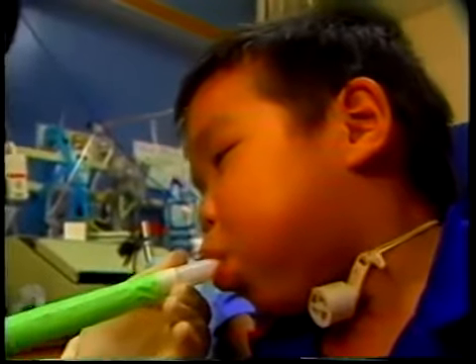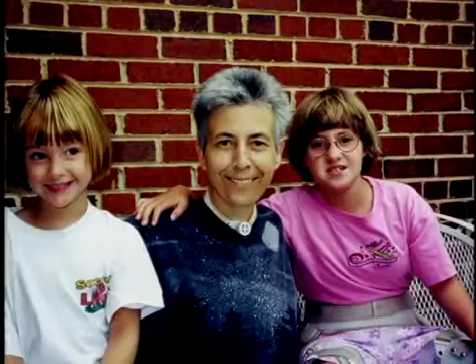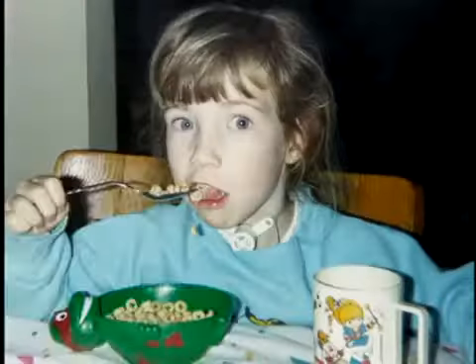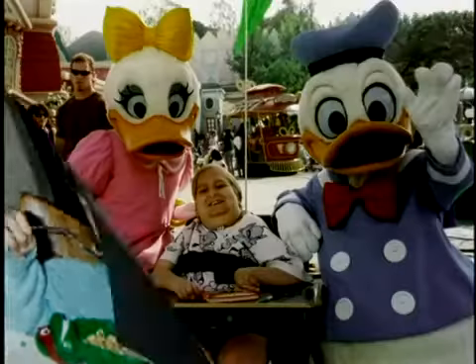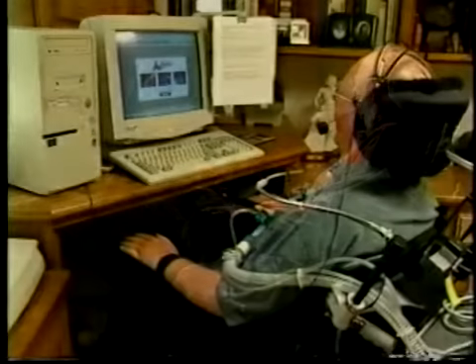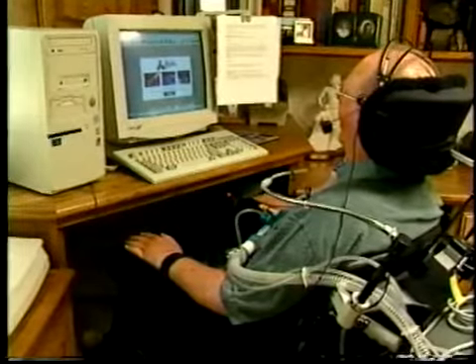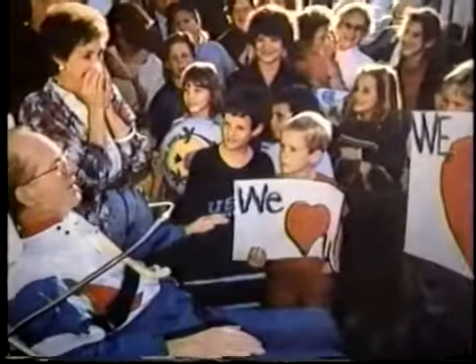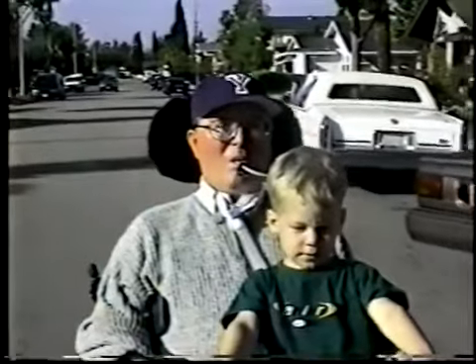Restoration of normal speech, reduced suctioning requirements, and improved swallowing also facilitate more active participation in life activities. Patients can function without feeling disabled and conspicuous because of their tracheostomy. Increased communicative ability can enable patients to regain control over their environment and facilitate an improvement in self-esteem and well-being.